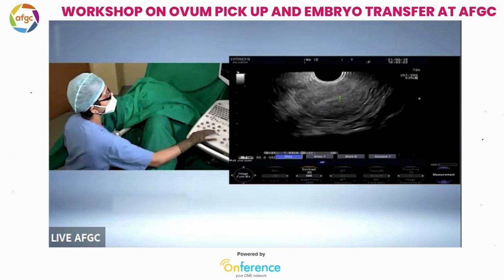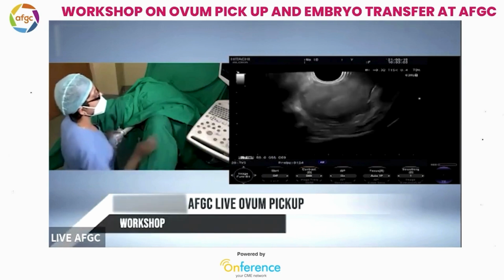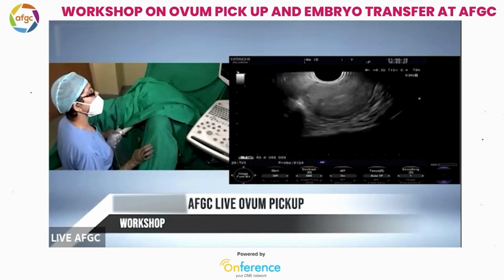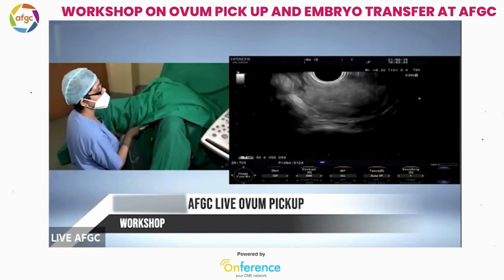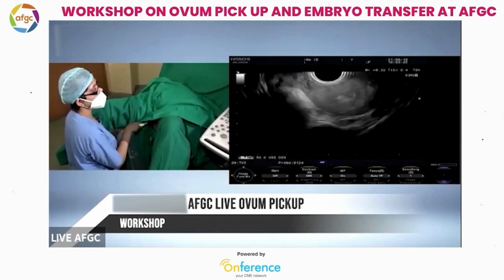And there is another one. Let me measure it and then check again, 0.5. So there are the 3 polyps. One is 0.4, one is 0.5, one is close to 1. And I'll check in the transverse plane.